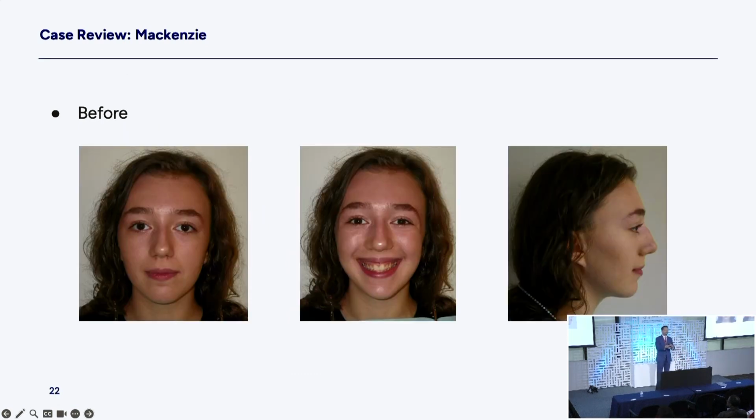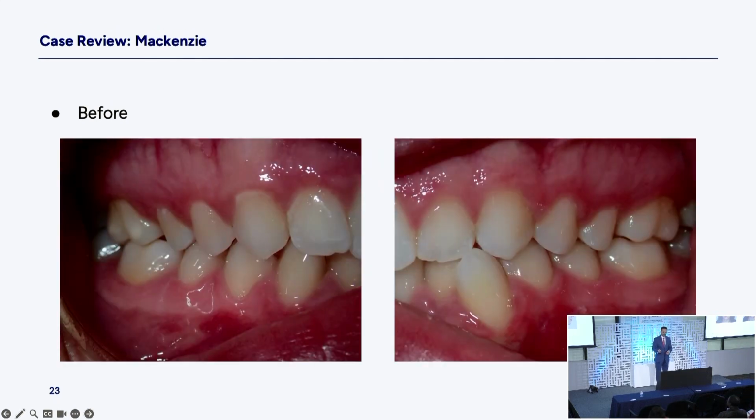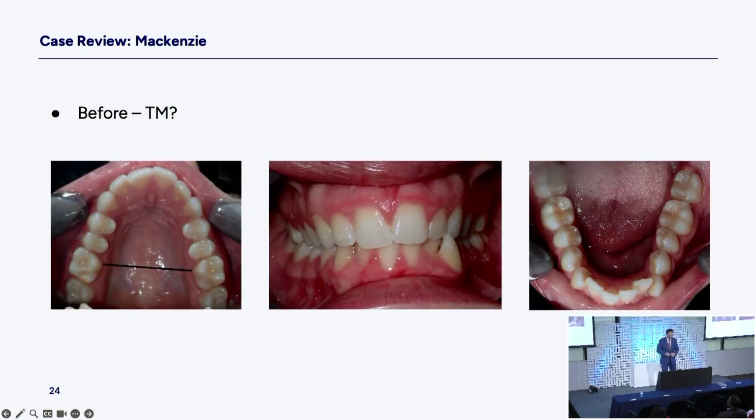Here she is with a smile. It's narrow. The lip line is wide, the smile is narrow. And then, of course, as we move into the case, we're going to see here we have a class 1 malocclusion, because every now and then we should look at a canine-molar relationship, and it's nice to see we are class 1 at the start, so we have a class 1. There's that fun canine right there, that's 22. It's even in a little crossbite with number 10 at the tip. Look at that, right? Looks like big trouble. I'm sure when we get to the pictures, we'll need IPR, Dr. Morelia.